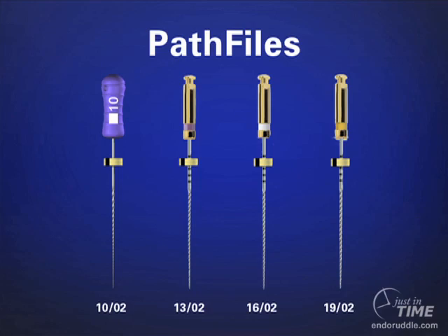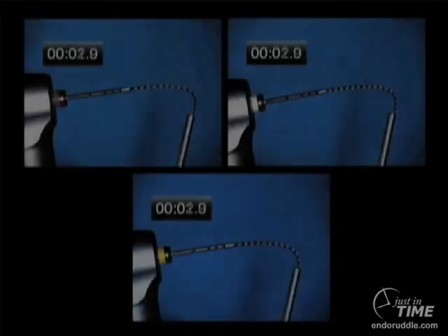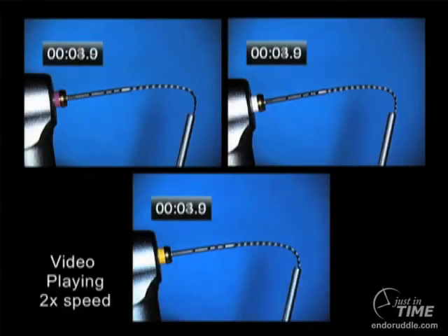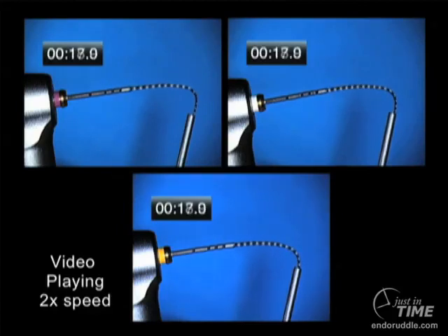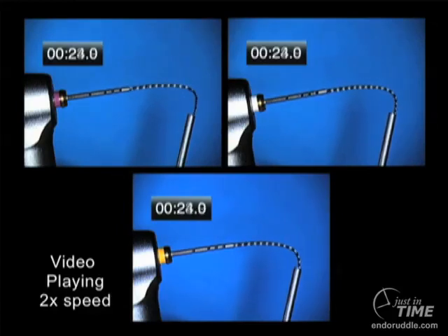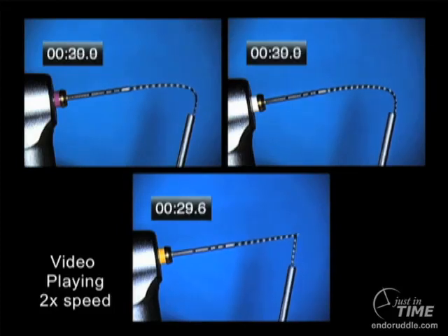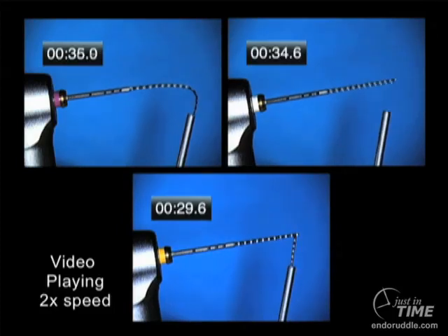Let's look at how we would use three path files to mechanically secure the glide path. I'm playing this video clip at two times the speed. You can see in the bottom image we're spinning the larger diameter yellow band handle — that's the 19 — and then we're using the white one in the upper right, and then finally the purple one.